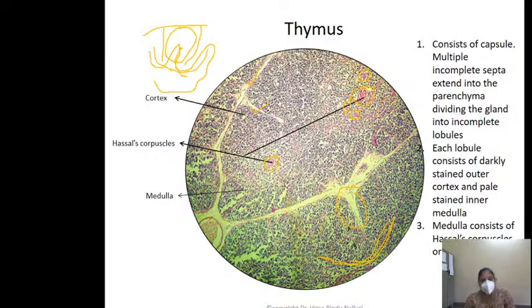And the palatine tonsil you can easily identify whenever you see the stratified squamous non-keratinized epithelium, and beneath the epithelium you see the aggregation of lymphoid follicles. That is the slide of palatine tonsil. No confusion in identifying these 4 slides.